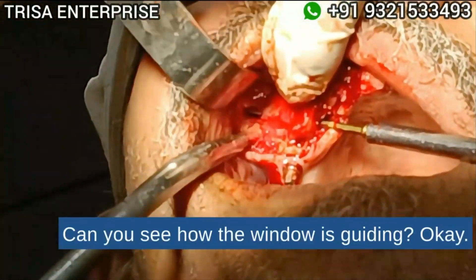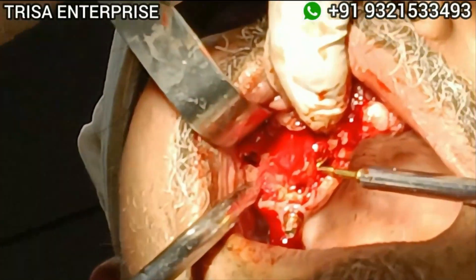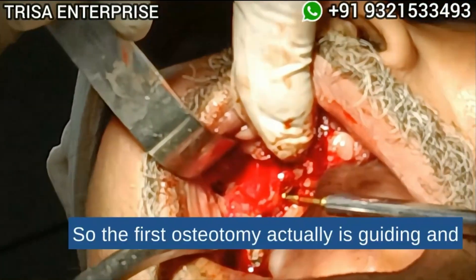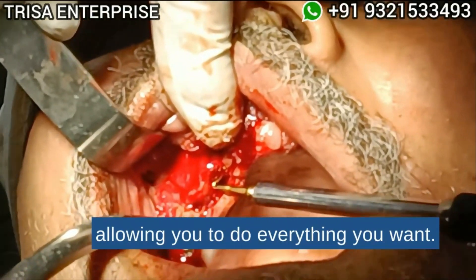Can you see how the window is guiding? The first osteotomy is actually guiding and allowing you to do everything you want.